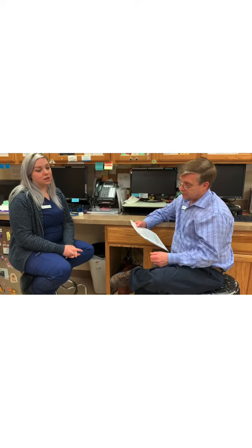Explain why non-essential personnel should be removed from the X-ray suite during exposures. Non-essential personnel should be removed from the radiology suite just to help keep their exposure down when taking radiographs.